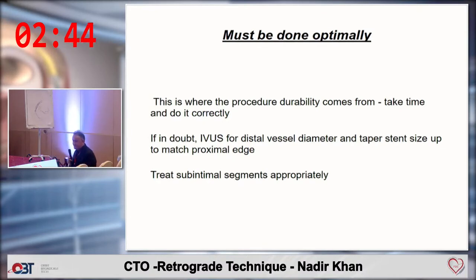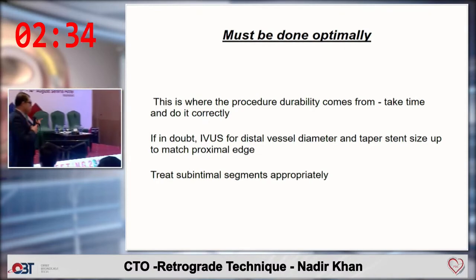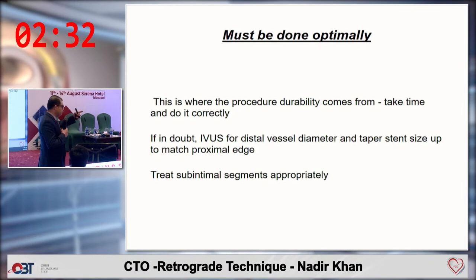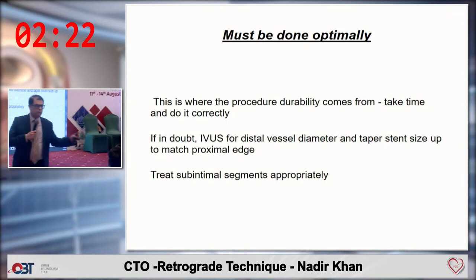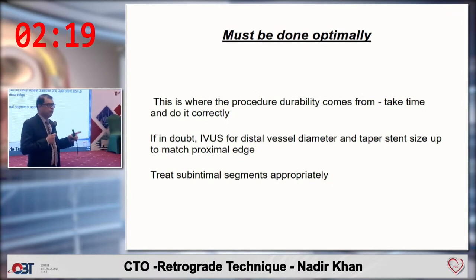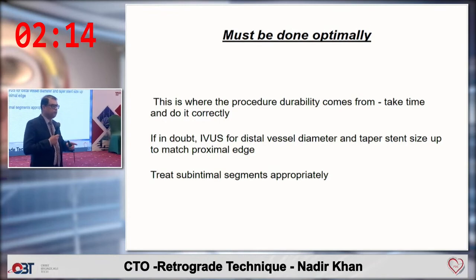So there is another technique, Omar, where you can withdraw your antegrade guiding into the ascending aorta or the arch and take your RG3 and engage into the guiding catheter without snaring it. So this is another thing that is possible. And the point that he's making is very important: only externalize with an RG3, which is an 010 wire. Normal CTO wires are available in longer lengths, 014, don't use them to externalize.